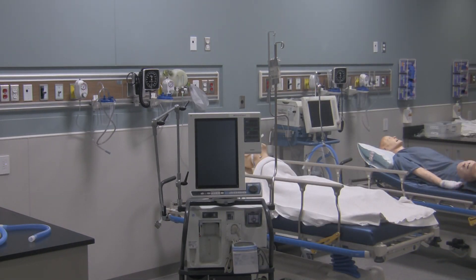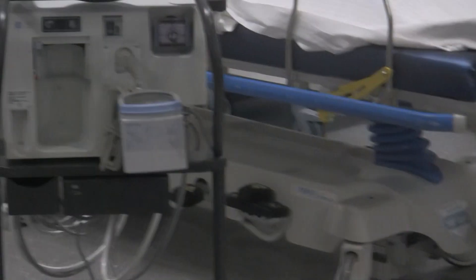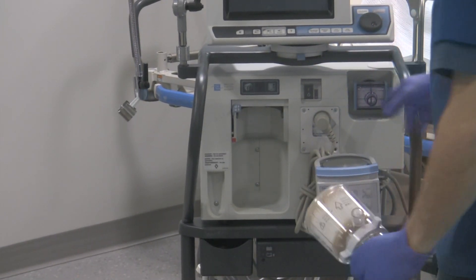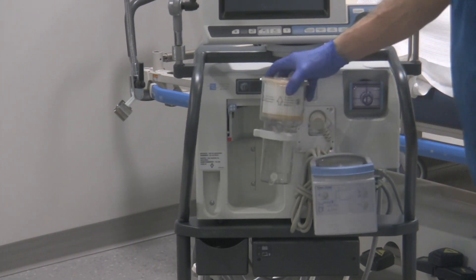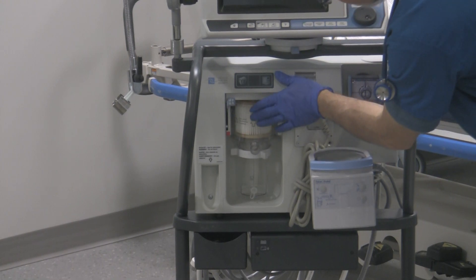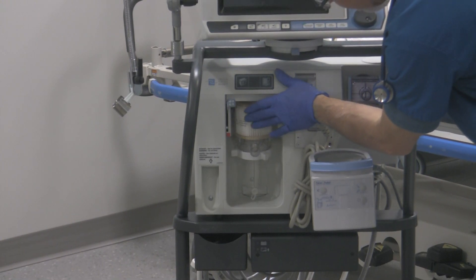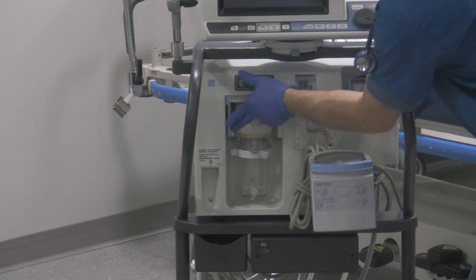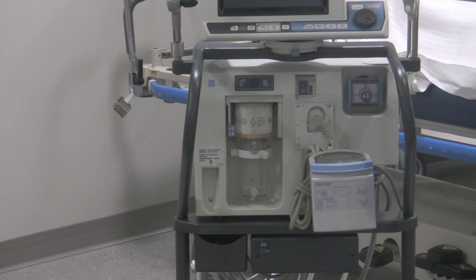Where does it go on the ventilator? It goes right over here. Make sure those ports are facing forward. Slide the filter and collection unit in — there's a locking tab right over here. Push that down to lock it in place to minimize leaks.